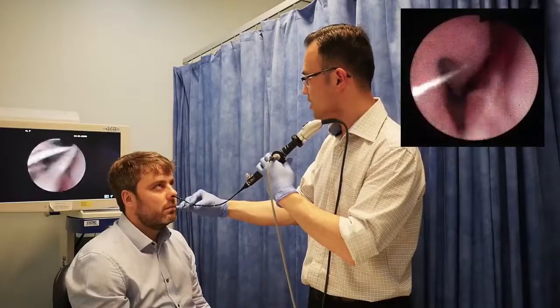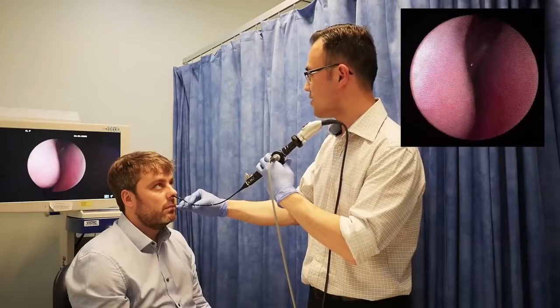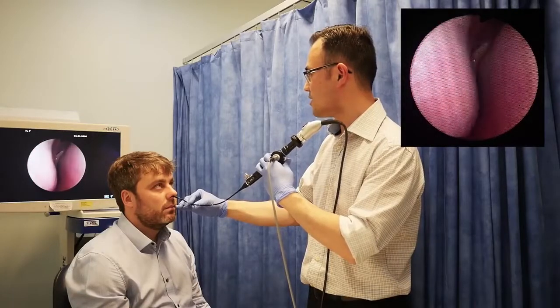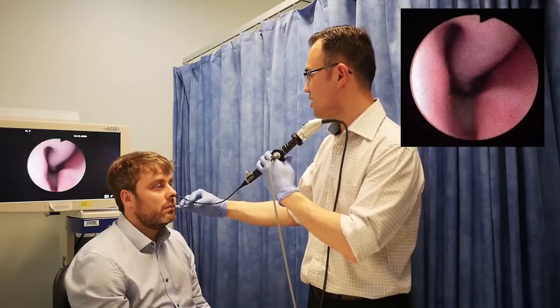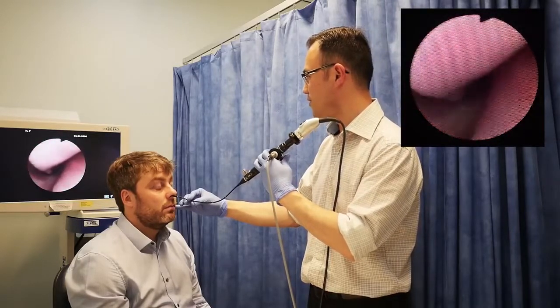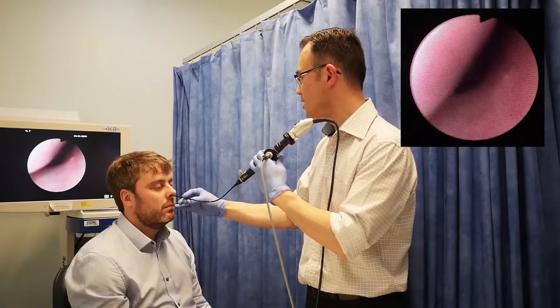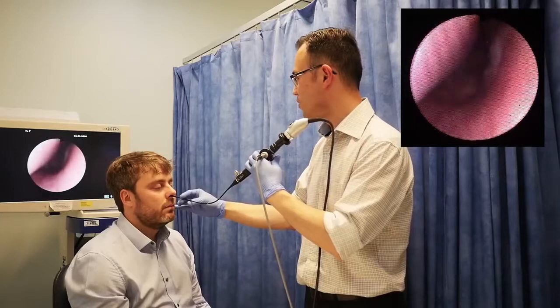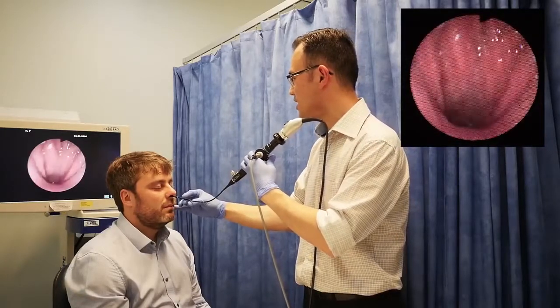And over here you can see the septum on the right, inferior turbinate over there. This is the middle turbinate. It's a little bit more narrow on this side, but we're just going to approach it again using the floor of the nose and this little tunnel here that's bounded by the inferior turbinate, septum, and the floor of the nose. Again, keeping the view always in the middle of the tunnel, and approaching again the nasopharynx.